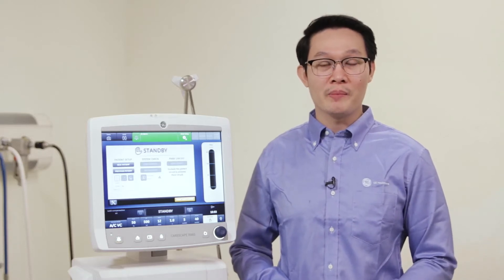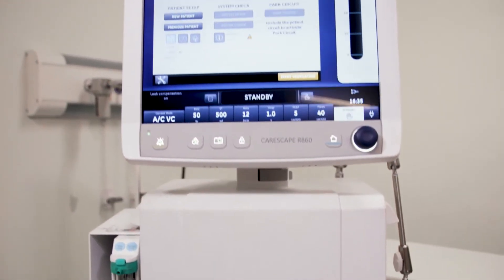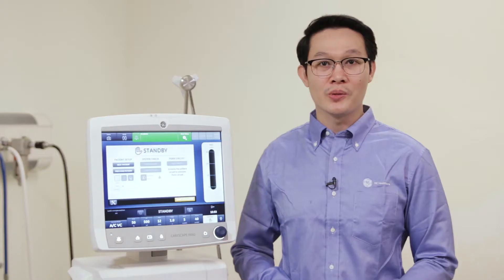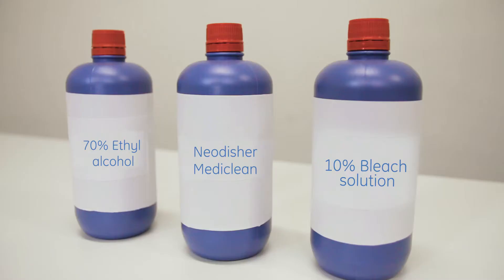The process used to clean the external surfaces will be the wiping method. These have been verified to be compatible with the ventilator but have not been validated for efficacy. The solutions that are compatible with the Carescape R860 ventilator are listed. In this cleaning process, I will use 70% ethyl alcohol.